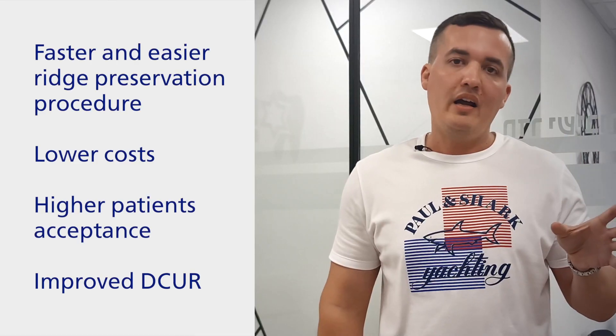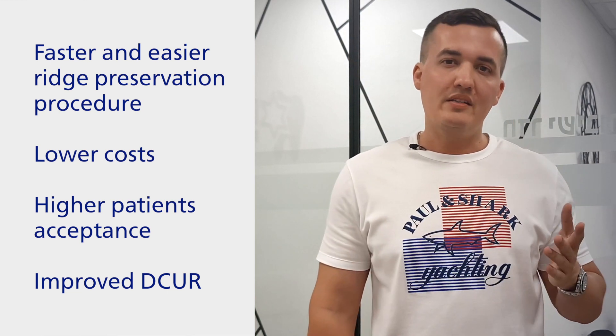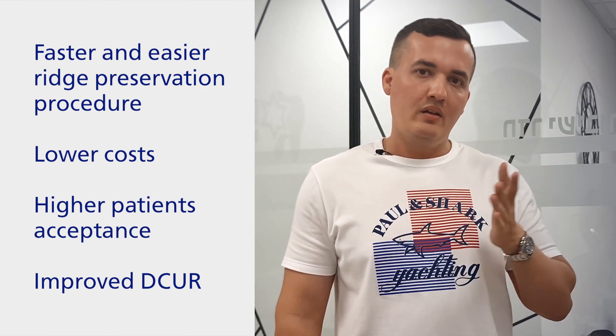After you extract the tooth, put the sponge graft in place and reschedule your patient for 12 weeks from now, being sure that upon arrival the site will be healed and ready for implant placement. A higher processing rate from the initial meeting to the final restoration means a higher patient turnover rate for your clinic and better cash flow.